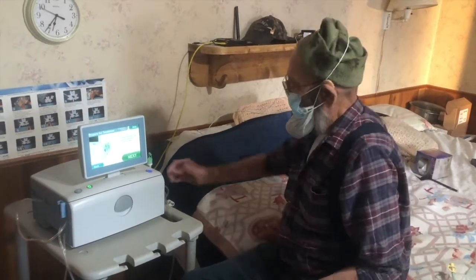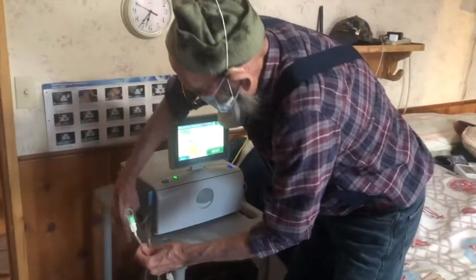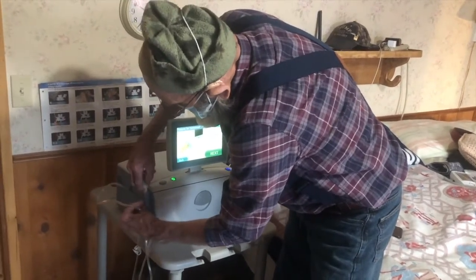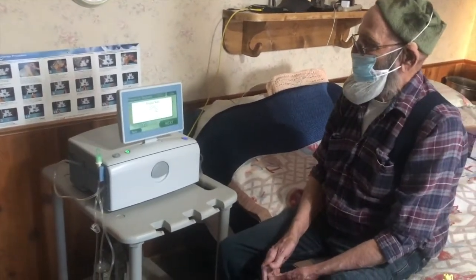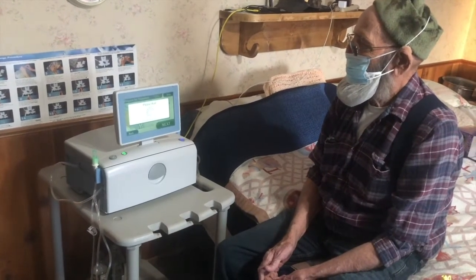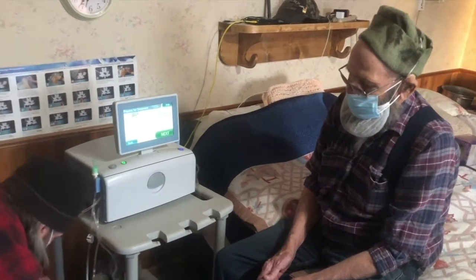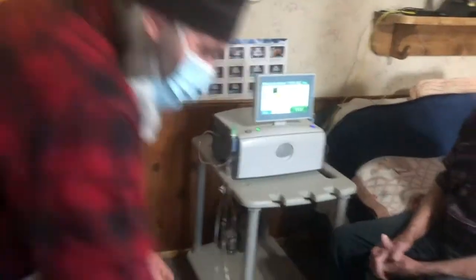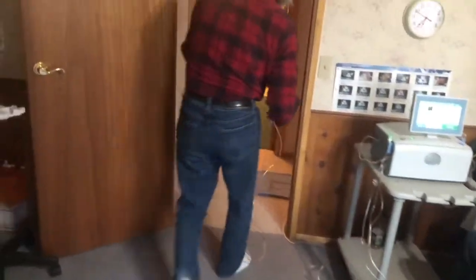Remove patient line from line organizer and place it in the patient line holder. You put that thing in the side here, and it goes in like that. Close the white clamp on the drain line sample port. Remove blue cap from drain line and place end in open drain. Leave an air gap between the drain line and the fluid. Watch what he does, and I'll explain that.